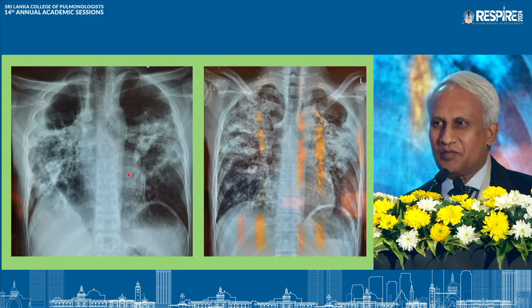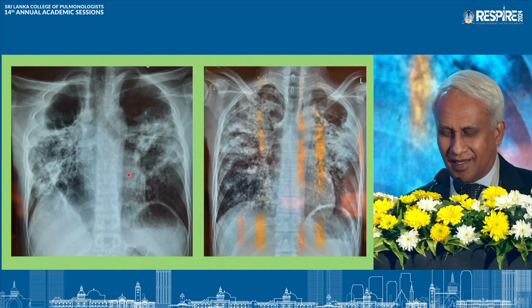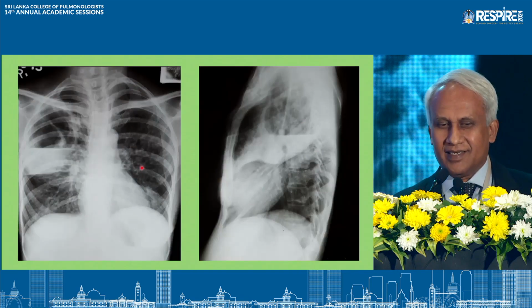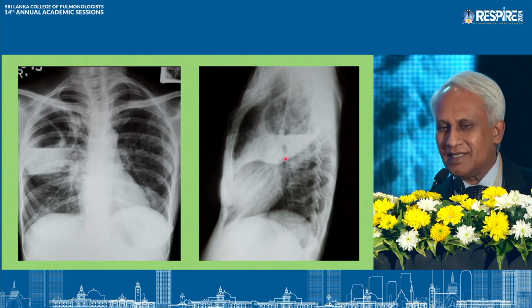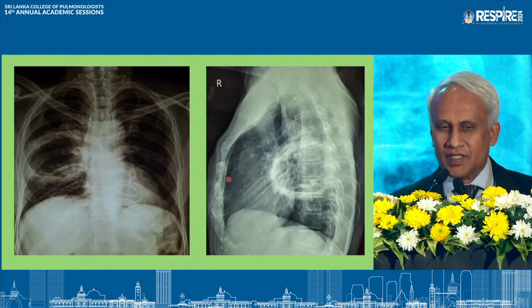So this is the type of patients that we see in Valisera, all are drug addicts. And I don't know how to control TB when you have these kind of X-rays. Another X-ray, you can see a cavitating lesion with a fluid level, and we call it lung abscess. You can nicely see the lung abscess in the apical posterior area, and you can demonstrate the oblique fissure and the transverse fissure here. So these are some cavities.